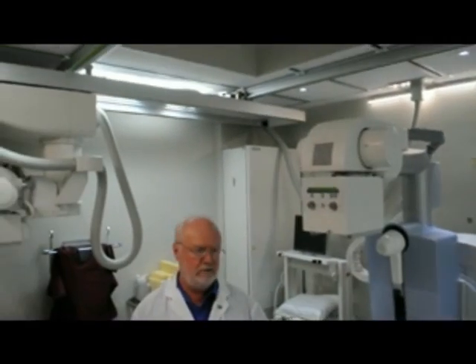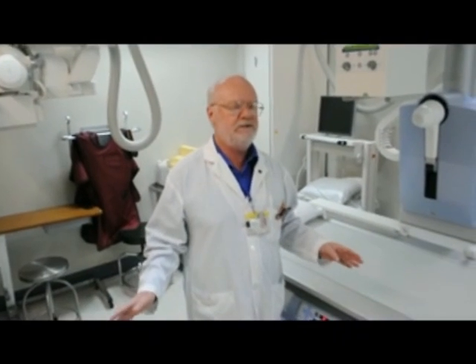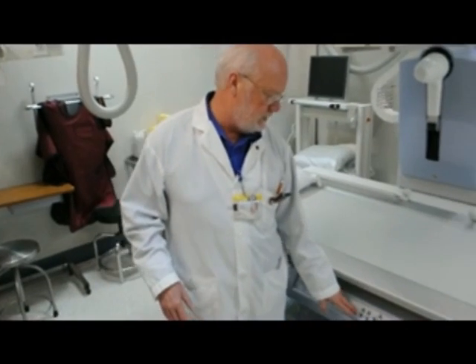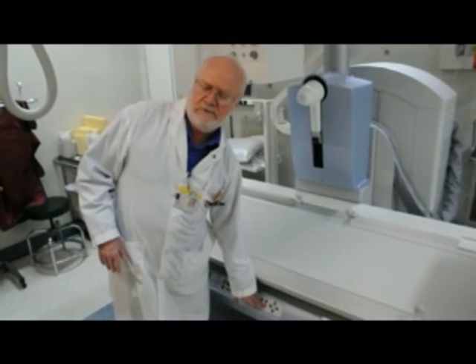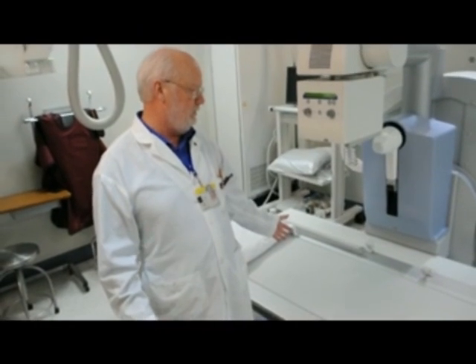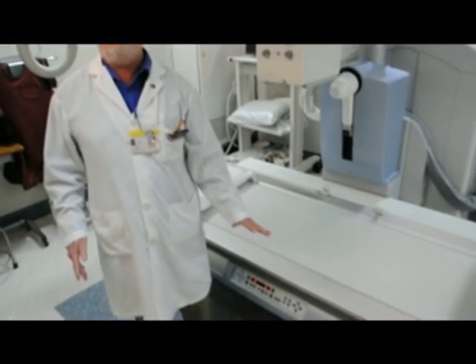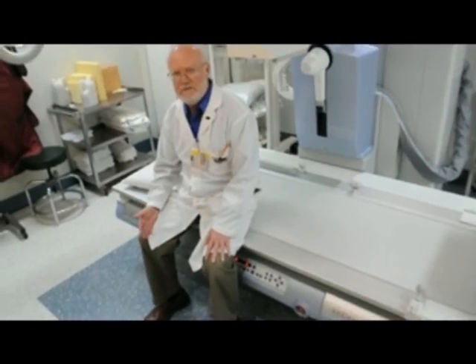The staff love it. The machine is so easy to use — it's user-friendly and extremely safe for the patients. It's all digital, so there's less radiation to the patients. With this new digital technology, all the parts that used to be underneath are no longer required, so you can just sit on it.